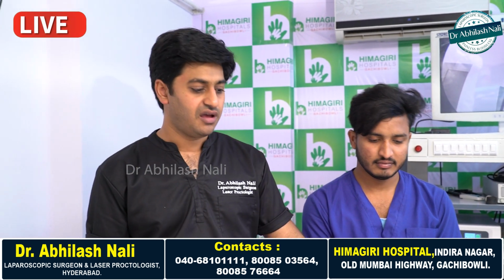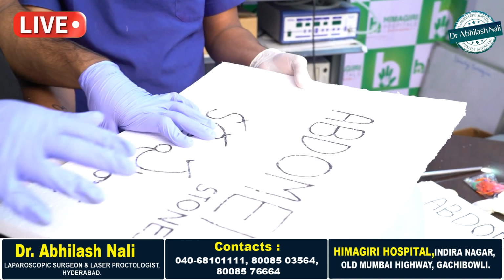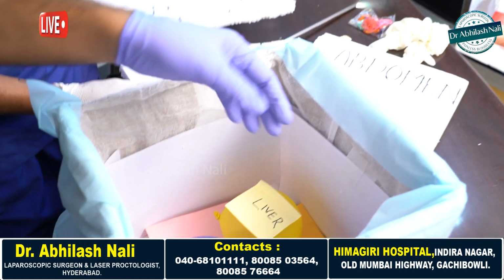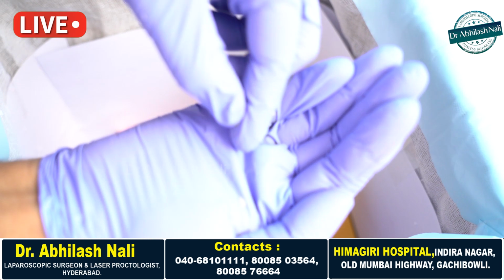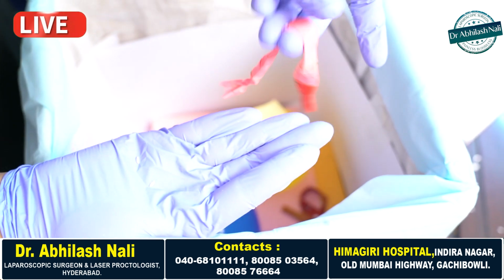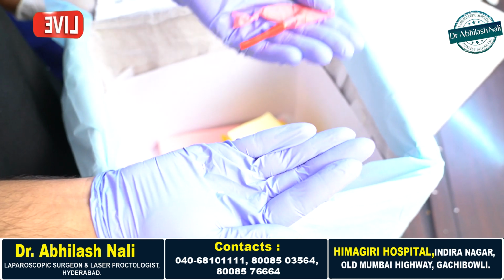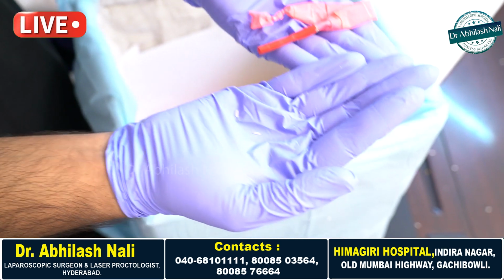For example, this is the patient's abdomen, the belly part, and if the patient has got multiple stones or worms, this is a replica of the stones. We can see a few rice grains inside the abdomen, and consider these unfilled balloons as worms. So this patient requires a surgery for this stone removal or this worms removal.